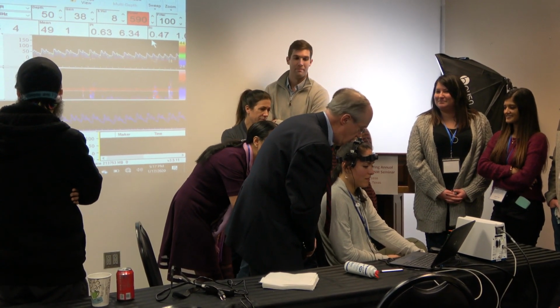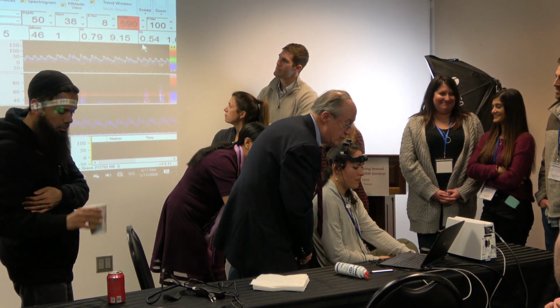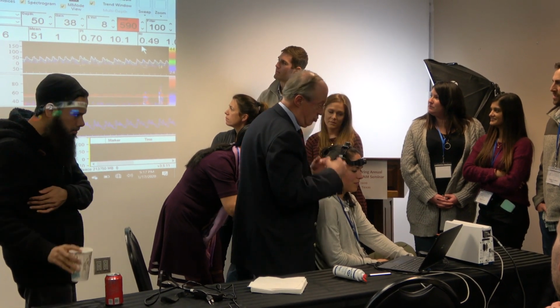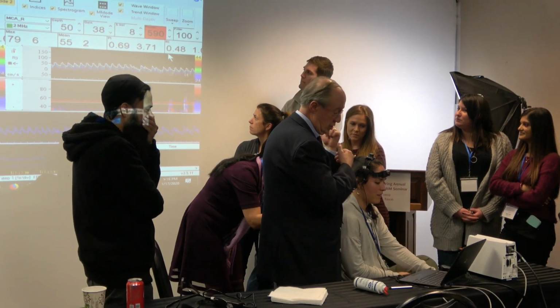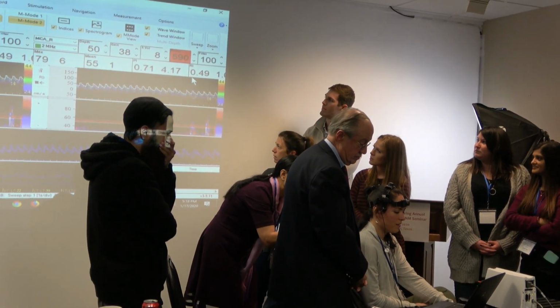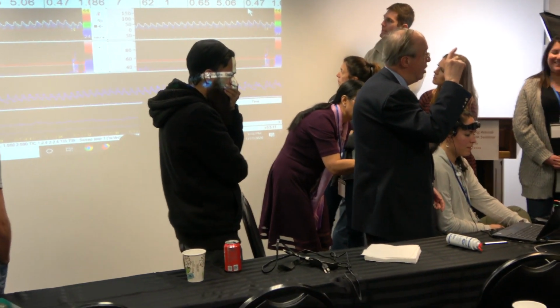Want me to stop now? So she stopped breathing, what will happen, CO2 will go up now. And what happened with middle cerebral artery, let's see. It goes up.